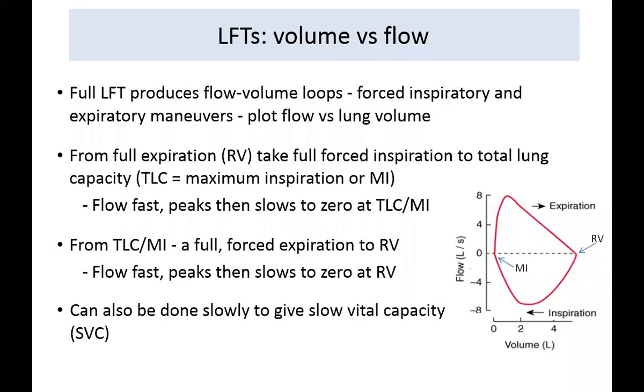How are we reading that volume? Is that volume inside the lungs? Because it's counterintuitive. Yeah. This is maximum inspiration, when you've got the biggest breath in, as far as you can breathe in, and volume at zero, then all the way down until you cannot breathe out any more air.